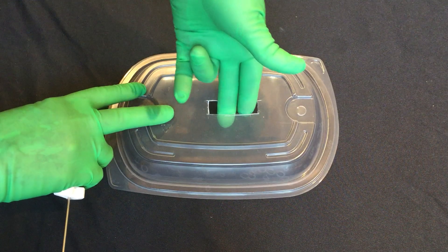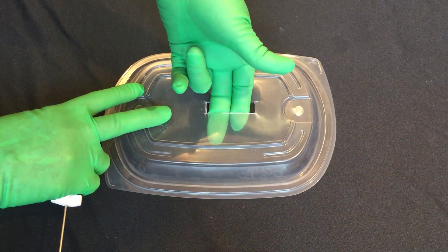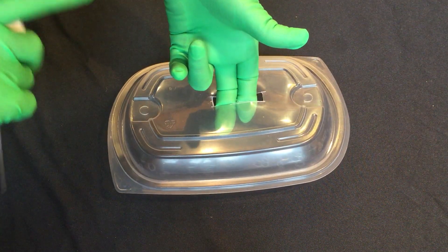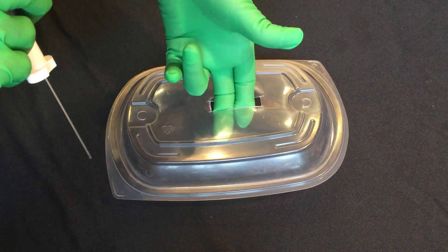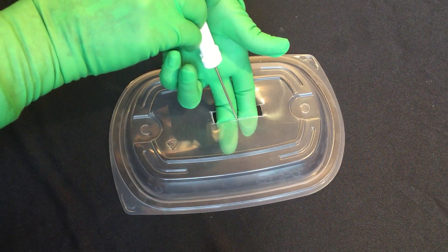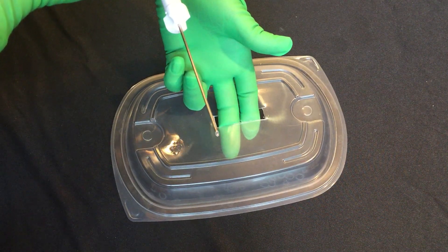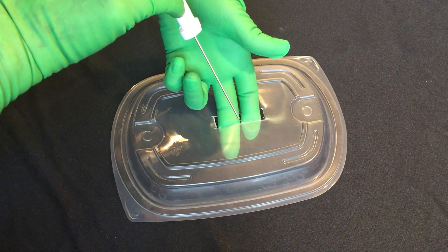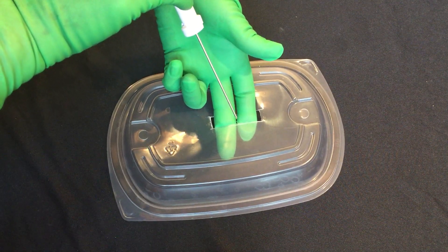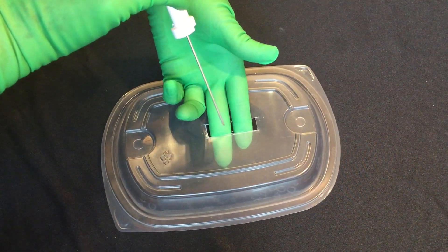What I used to do is put my fingers in there — it's going to take two fingers to help maintain cover as much as you can, but you're still going to have leakage. You have to lift up on the abdomen because you can't maintain the pneumo, and I would slip my suture passer between my fingers to catch the fascia. But as you can see, I'm putting something with a very sharp point right through my fingers, and it's blind — you can't see through the abdomen — so there's a good likelihood you're going to put a hole in your glove or poke yourself.